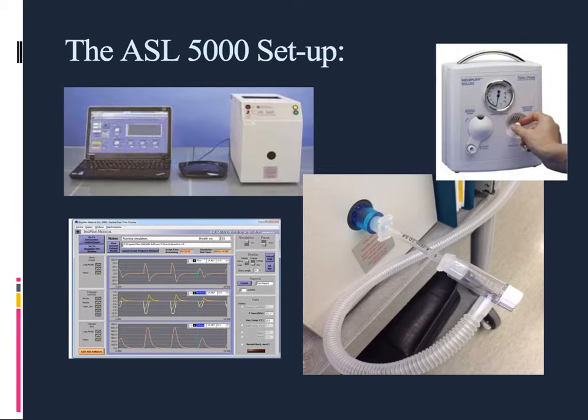I used a 5.0 endotracheal tube because that's approximately the size of a trachea of a neonatal patient. I know that because you can comfortably put about a 3.5 endotracheal tube inside the 5.0 tube, and that's how I came up with using the 5.0 for the spontaneous tracheal model that you'll be seeing and I'll be talking about later.